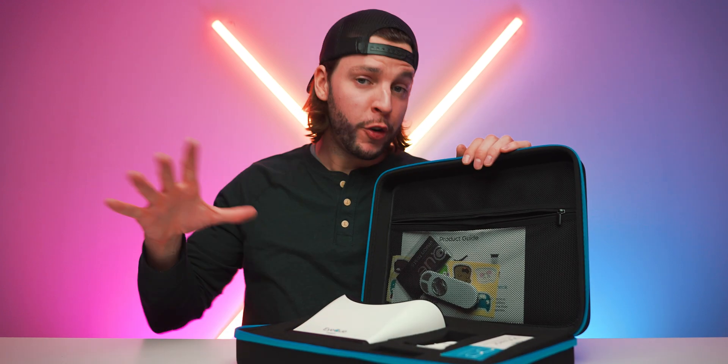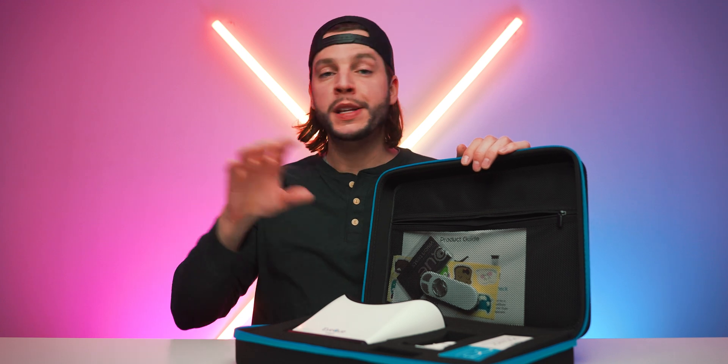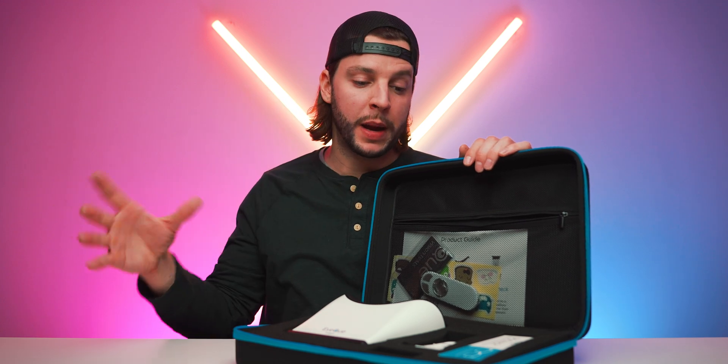Today we're going to be taking a look at a few of their products and walking you through what each one does. Everything you're about to see is included in the IQ vision monitoring kit — that's the best value you're going to find, with all the different pieces of equipment and technology we're about to talk about bundled together.